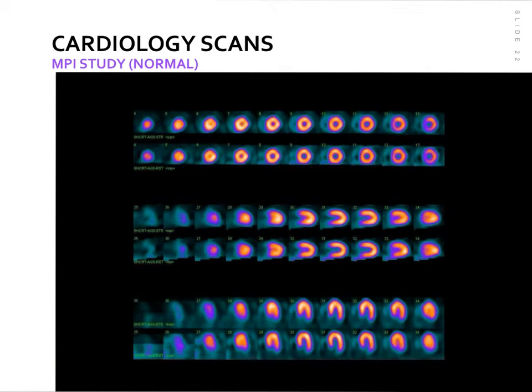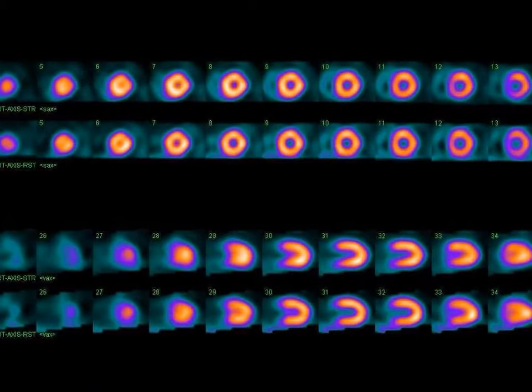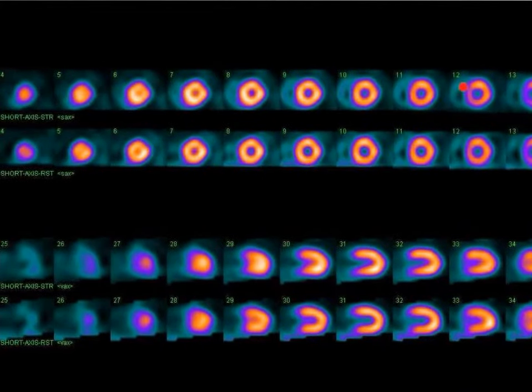Here is a great example of a normal myocardial perfusion image. So if we zoom this up a little bit, you can see it a little better. What we do is we will take two sets of images of the patient. The bottom row of each set are actually the resting images down here, and then the top row of each set are going to be the stress images. So what we do is we'll do the resting images first. So we'll inject the 99M sestamibi or cardiolite into the patient. We wait about a good 45 minutes to an hour, and then we'll take the first set of pictures. That'll be our resting image. What we're looking at on these images is specifically the left ventricle.